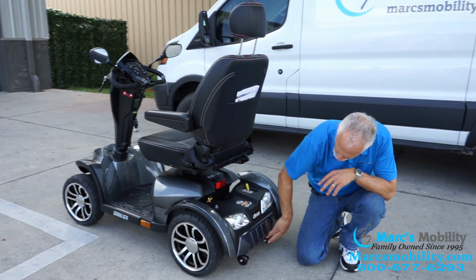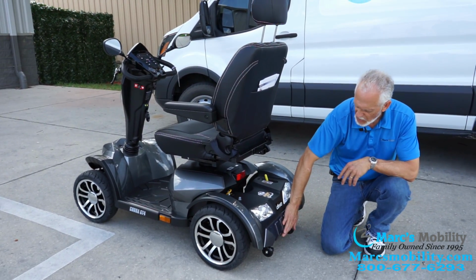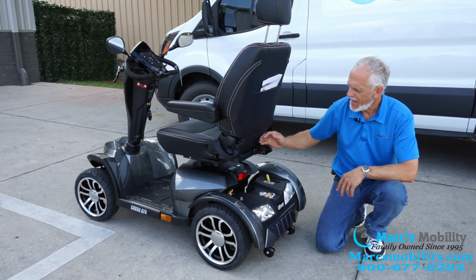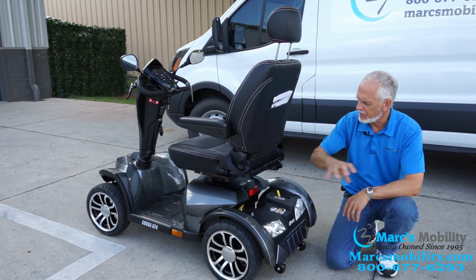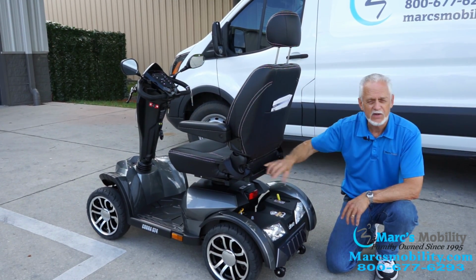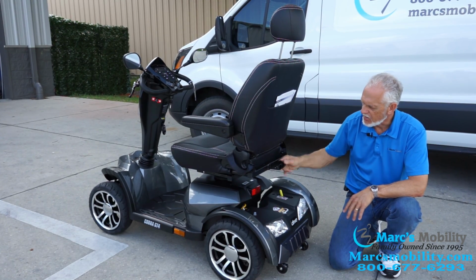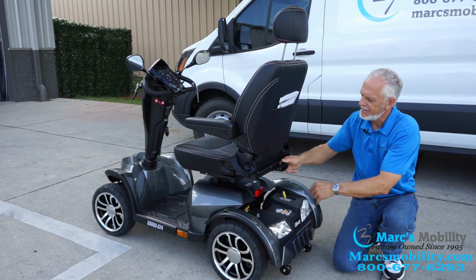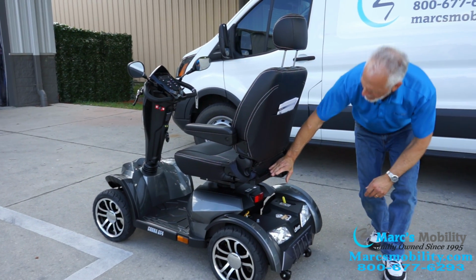Also, you have tip wheels back here, anti-tip wheels. You have one on each side. You have a bumper here. You also have over here a basket holder. So if you want to put a basket on here, oxygen holder, cane holder, whatever you want to put, your docking device is right here, and you just put it in and tighten it up with this knob. It'll keep it from coming out. This is your docking device right here.